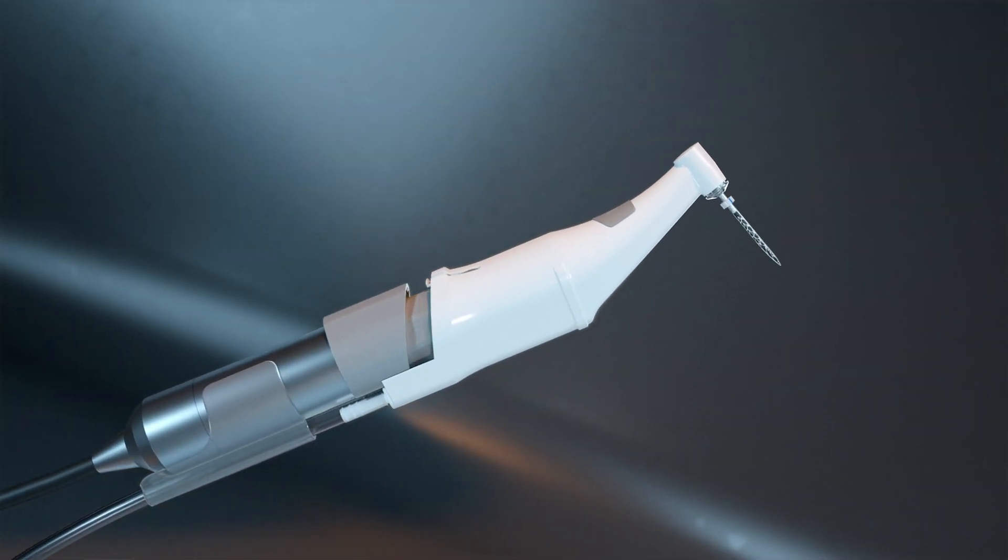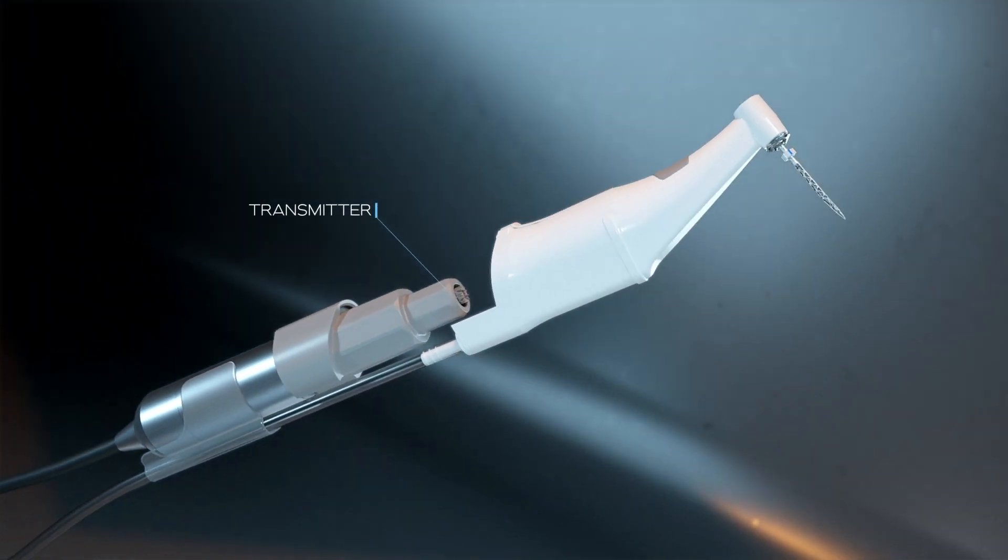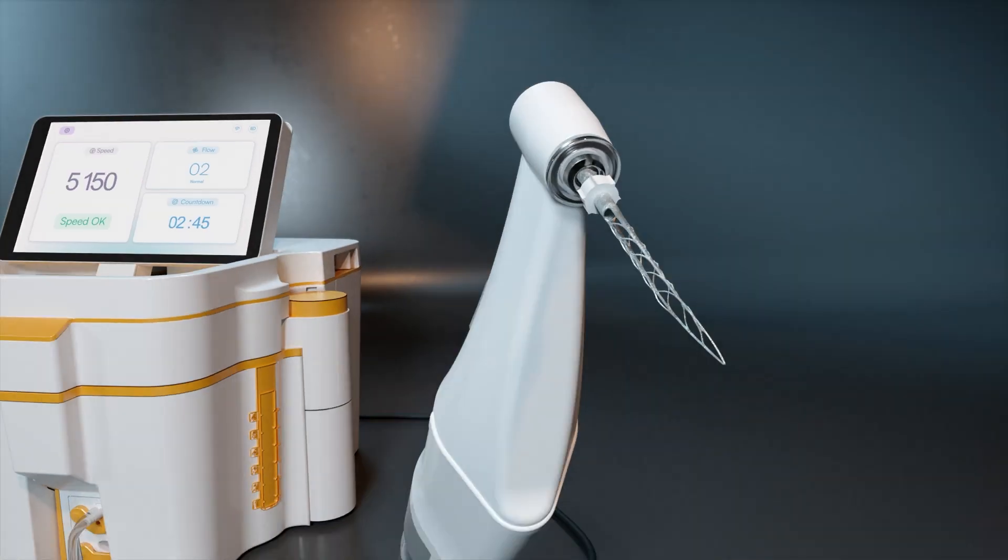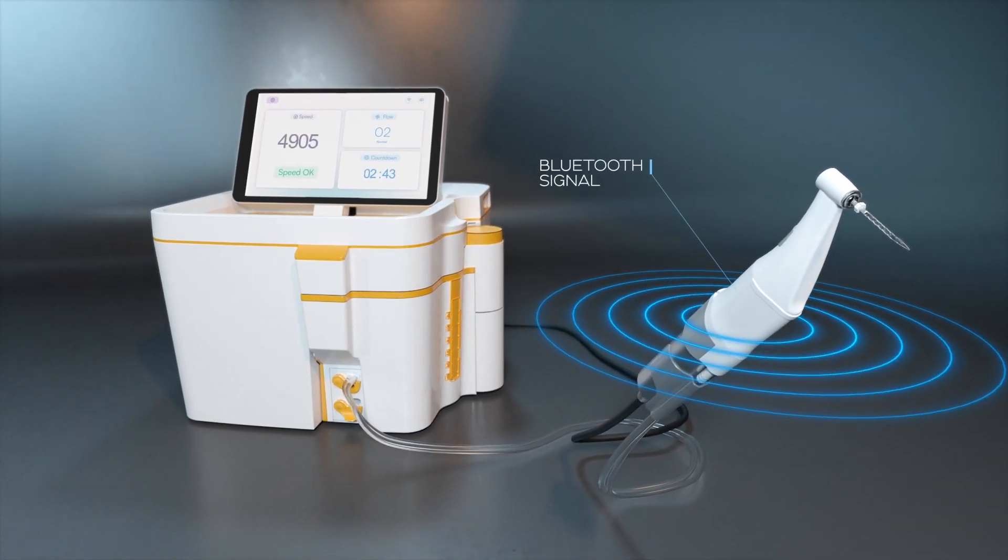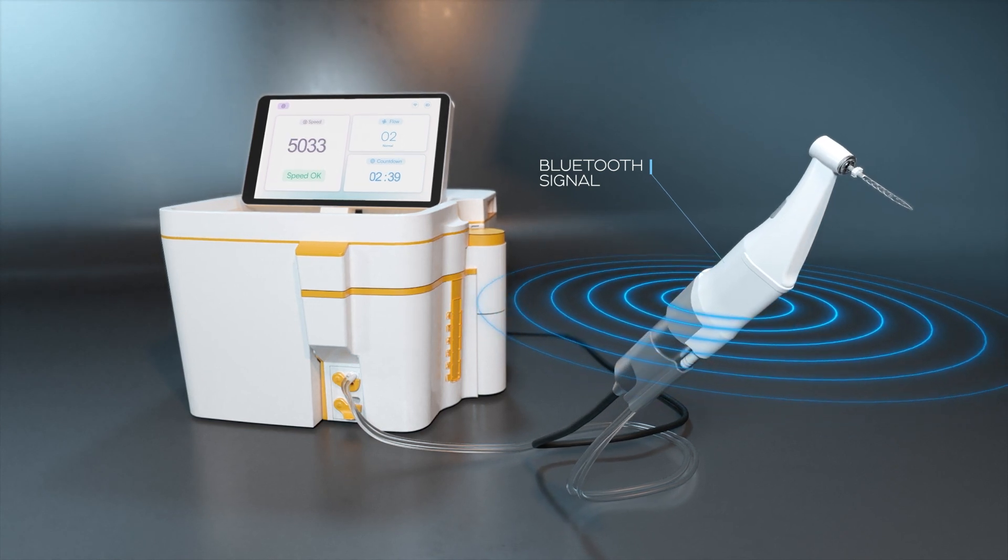The handpiece is fitted onto a reusable transmitter that generates its own power from the micromotor center, sending a Bluetooth signal to the main device indicating the operation of the motor and monitoring the rotation speed.